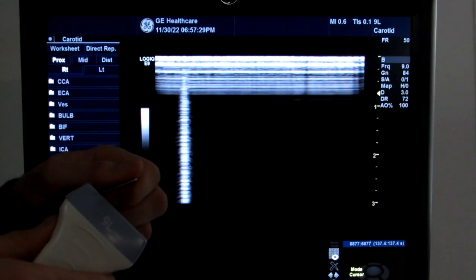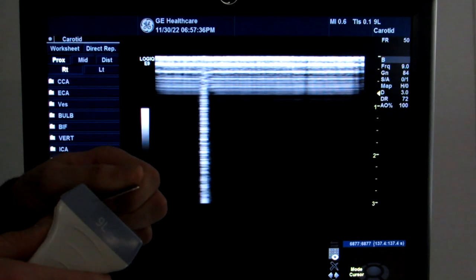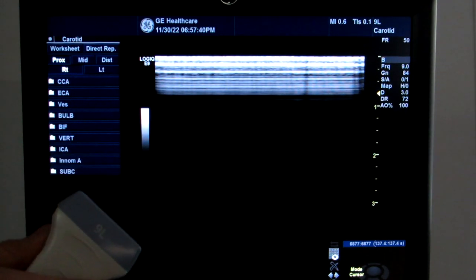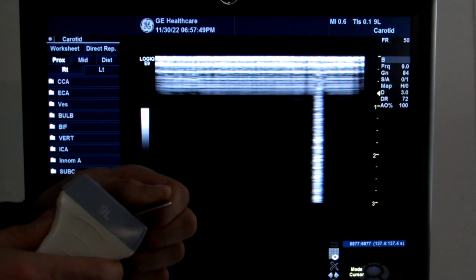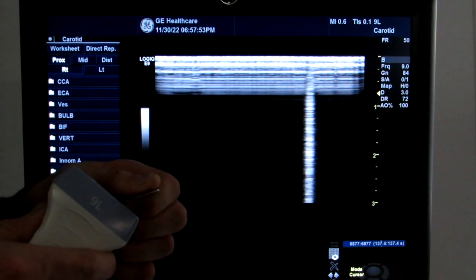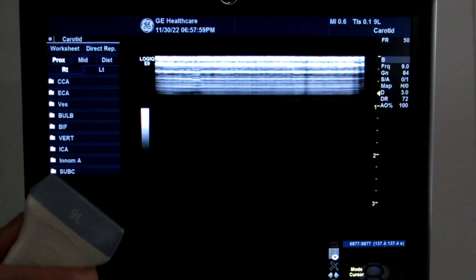When you apply your QA test tool to the face of the probe you'll see this bright comet tail, and on a good probe as you move the test tool across it will stay the same brightness. However on this probe as we get to this area over here where there's a dark band you'll see a change in brightness. That flashing and that drop in brightness confirms that we do have dropout on this probe.